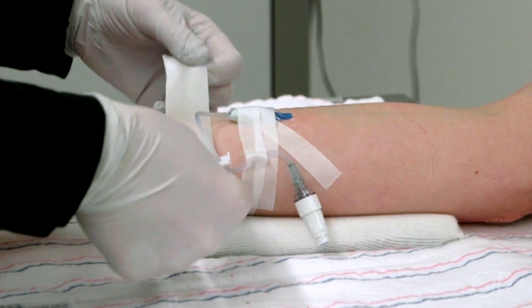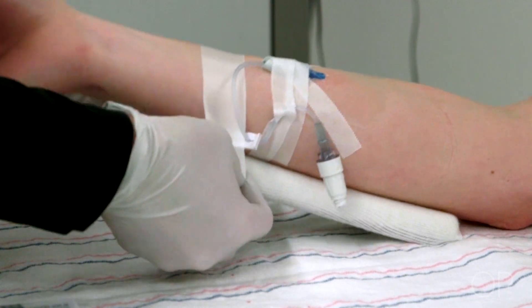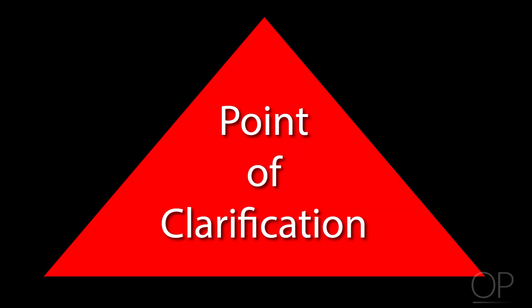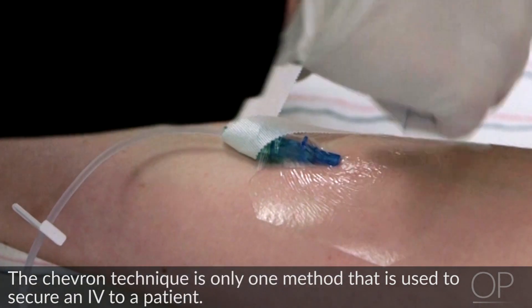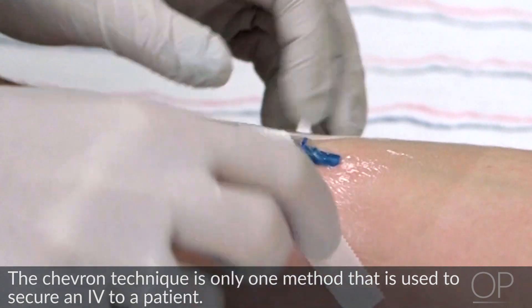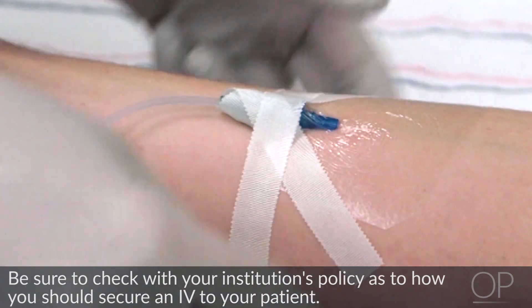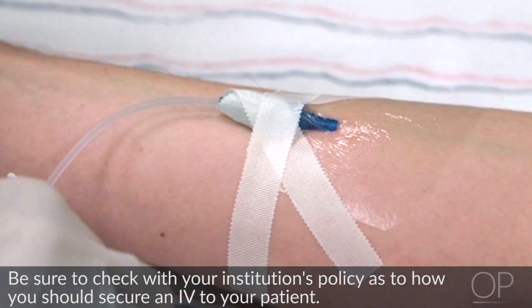When an IV is placed over a joint, use a supporting device such as an armboard to keep the child from bending the extremity. Point of clarification: the chevron technique is only one method used to secure an IV to a patient. Be sure to check with your institution's policy as to how you should secure an IV to your patient.